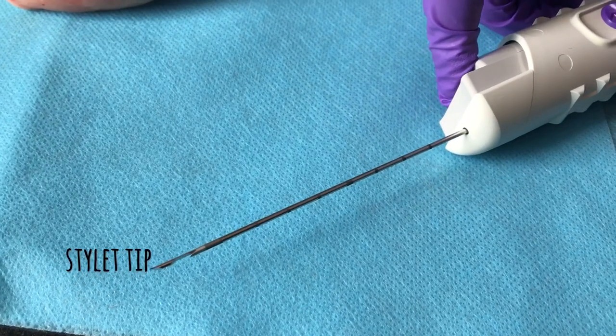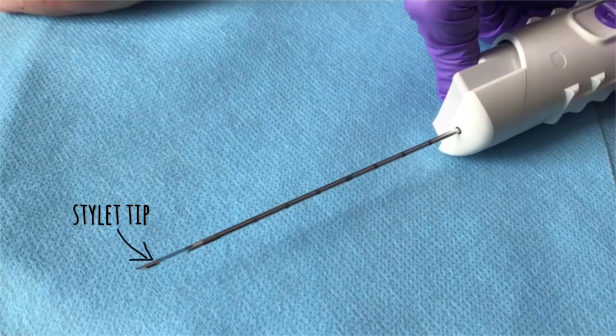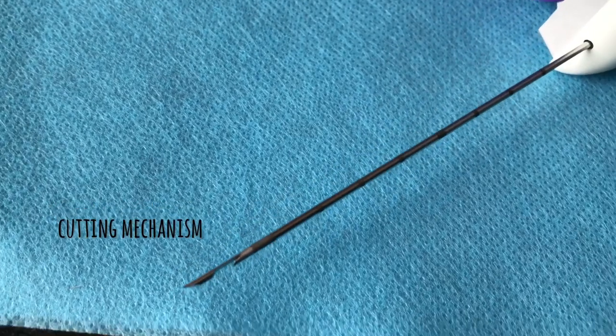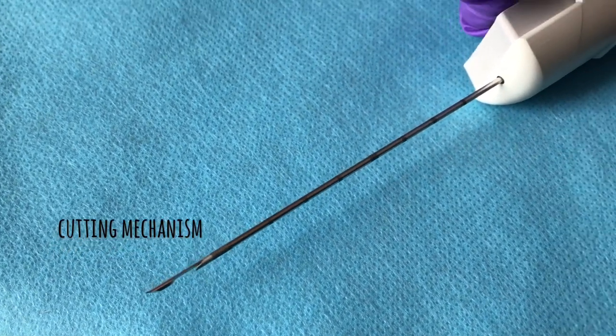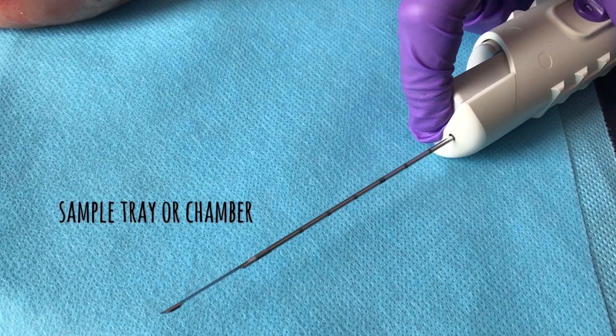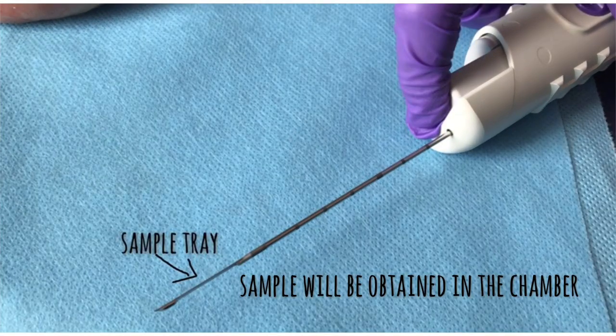This is the core biopsy gun. The stylet tip is sharp and it helps to penetrate into the tissues. This to-and-through motion is the cutting mechanism. The chamber has two sharp edges and the sample will be present in the chamber.